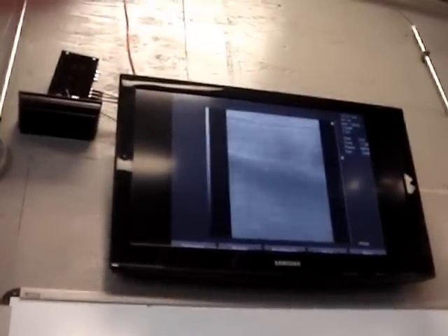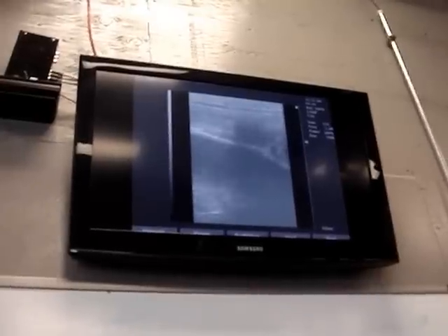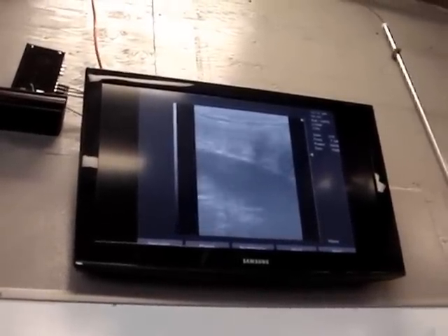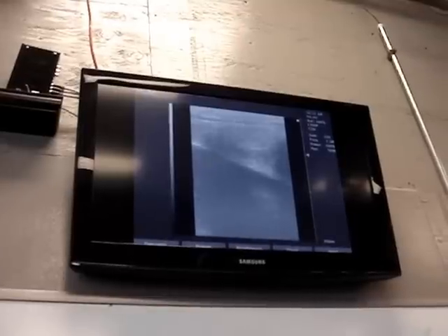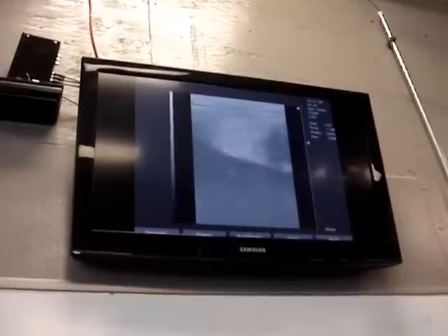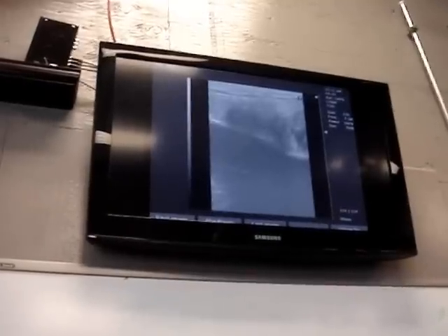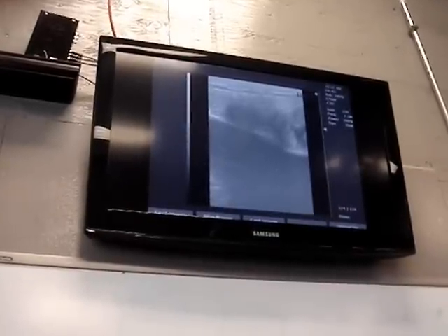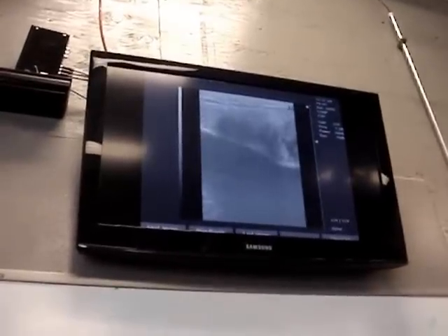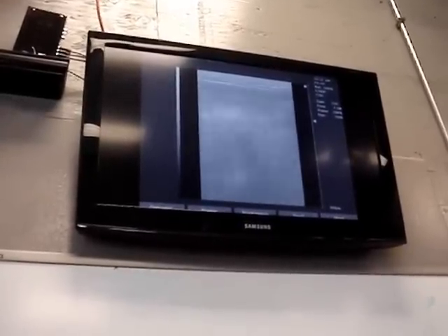So to start out here, in ultrasound, if you guys have never seen ultrasound before, fluid is black. It's kind of the opposite of radiology or x-rays. So fluid is black, and then more dense tissues are a little bit more white. So you can see there's a big body of fluid or black portion on the bottom there. Do you guys know what that would be? Bladder. Very good. You guys are so smart. So exactly, that's her urinary bladder there.